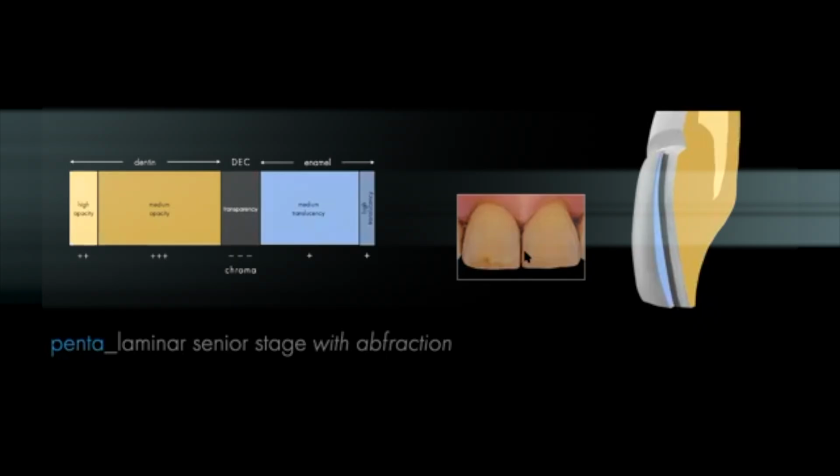So we cannot take this as a reference for making new teeth for our patients, right? This shouldn't be our model for layering, because that becomes really a weird situation where we are mimicking things that only happen on pathologic teeth, but we are trying to put new smiles and new younger teeth on our patients. So it's actually not really working to get this kind of effect.